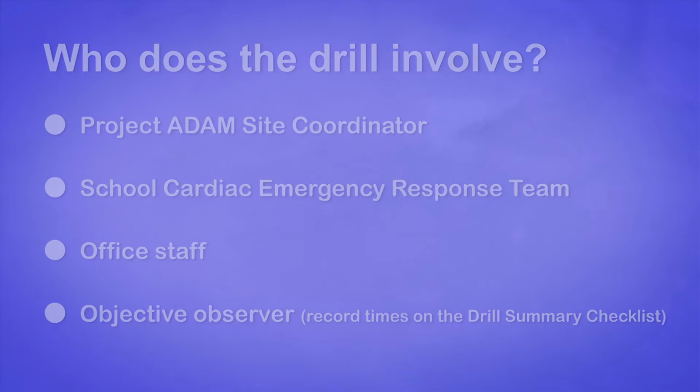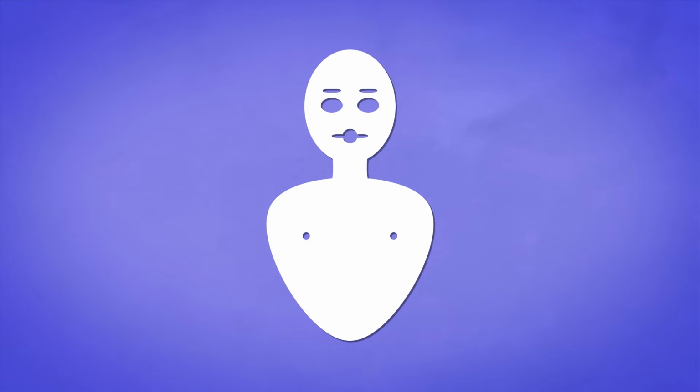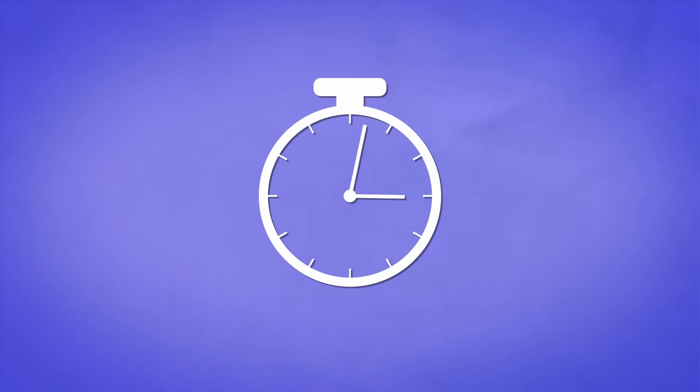What will you need? AED training unit, a mannequin, a cell phone or telephone, AED drill summary checklist on a clipboard with a pen, and a stopwatch.